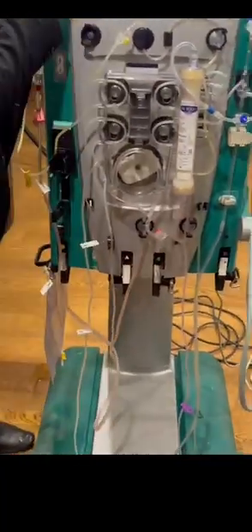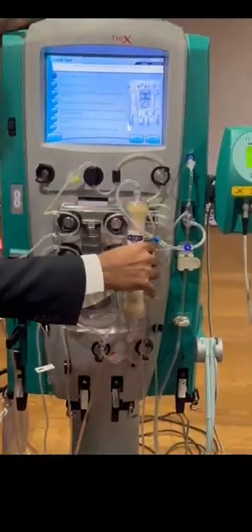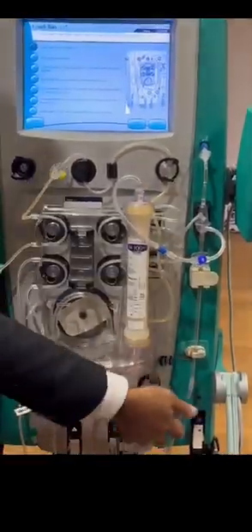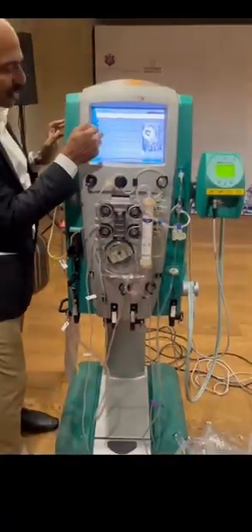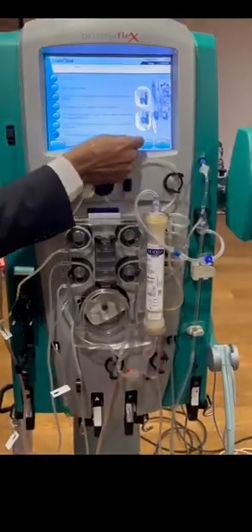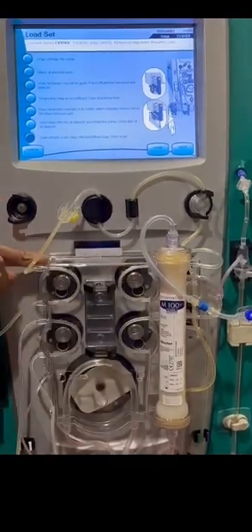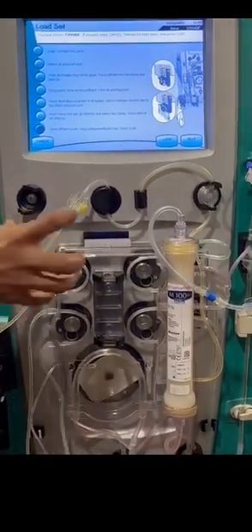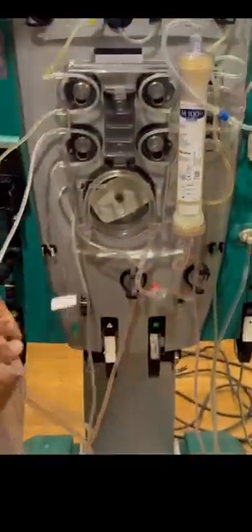We have connected all these things: we kept this cartridge, then these pressure ports, then this line. We need not click here; if he knows, we can do that. Then press load. If you press load, it will be fixed in this part, in the pump segment. So before loading, we have to make sure these lines are open.